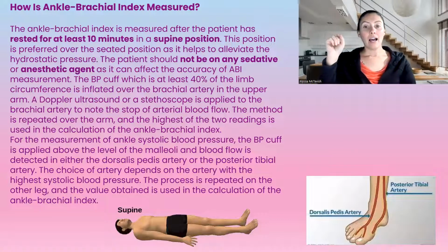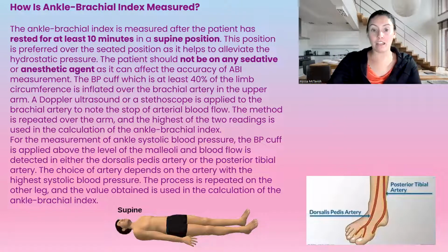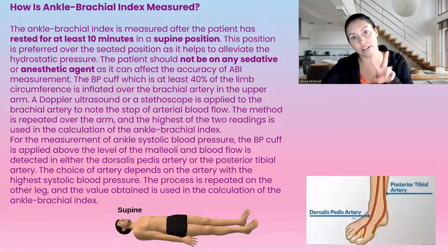Then we do this for both ankles. Just above the ankle, we put the blood pressure cuff, and we are going to do 2 arteries on each foot.